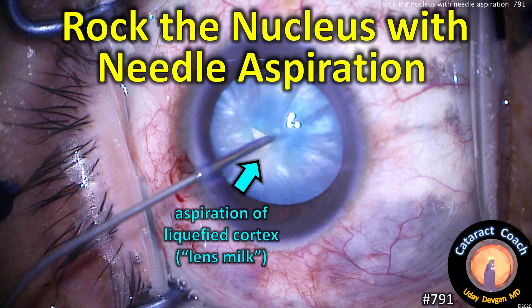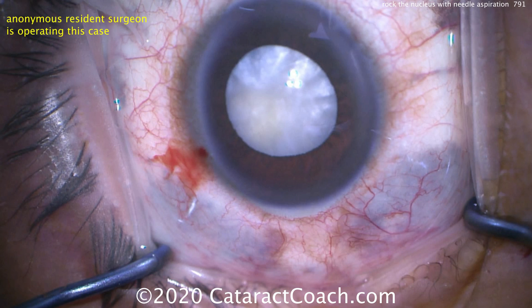CataractCoach.com. Rock the nucleus with needle aspiration. This is for those milky white intumescent cataracts.